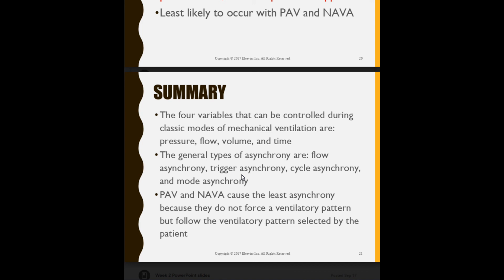If, for example, I have a patient on volume control and they have ARDS, my peak and my plateau pressure are going to rise.